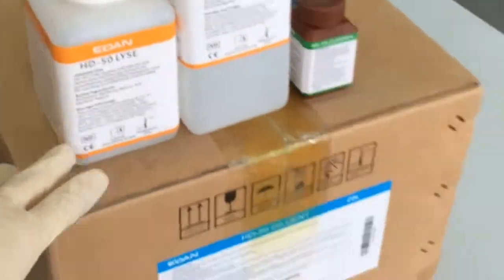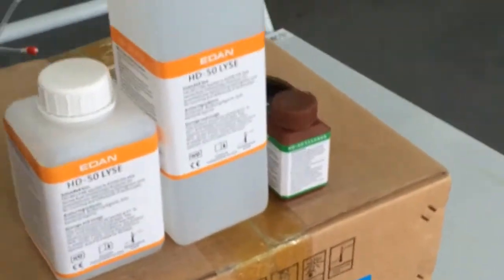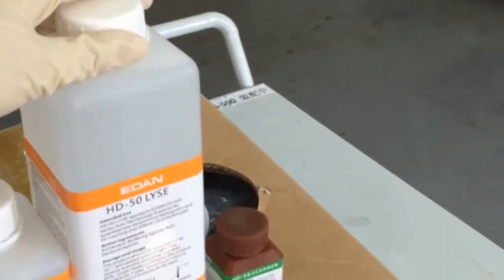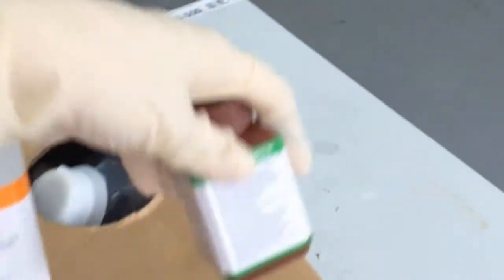We also have three reagents in our system. That is diluent, lyse, which has two versions - one is 500 milliliters, the other one is one liter - and last but not least is our cleanser.